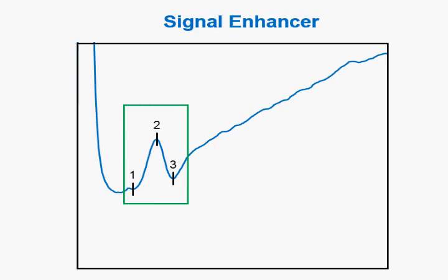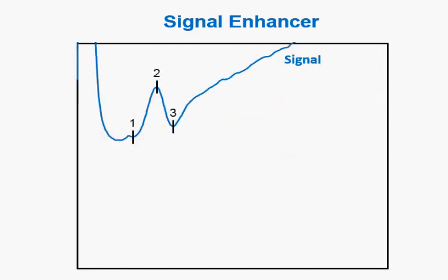It has a very short duration and it changes direction rapidly. In contrast, the stimulus artifact is a slowly changing signal with U shape. These differences in signal characteristics are analyzed by a digital signal processing algorithm to identify the artifact and remove it.